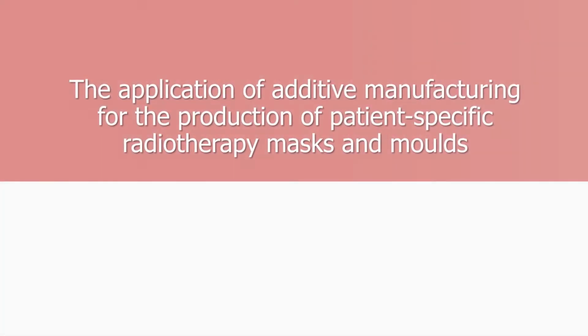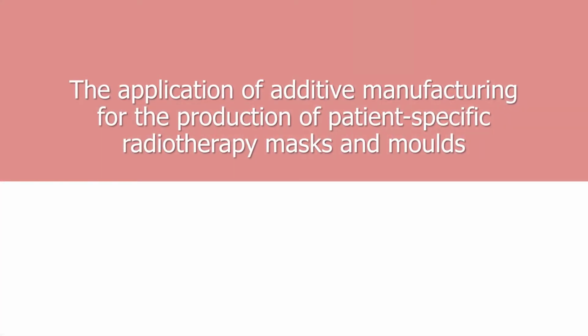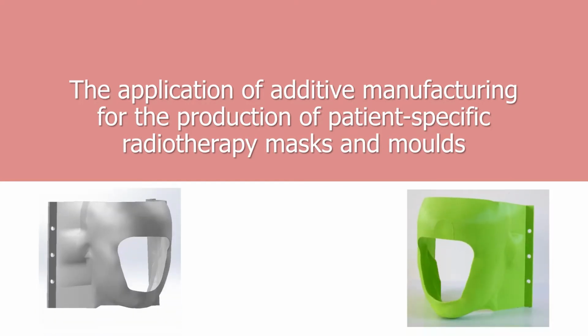Hi, I'm Hannah. My project is titled The Application of Additive Manufacturing for the Production of Patient-Specific Radiotherapy Masks and Molds. Immobilization masks are used to ensure radiotherapy treatment is accurate and to make sure the highest dose possible is given to the cancer whilst minimizing the damage to surrounding healthy tissue and organs.